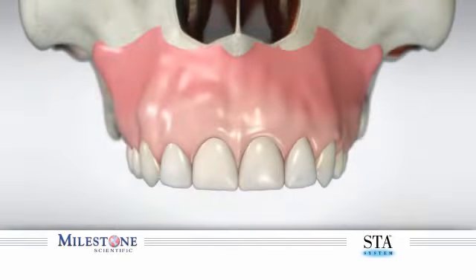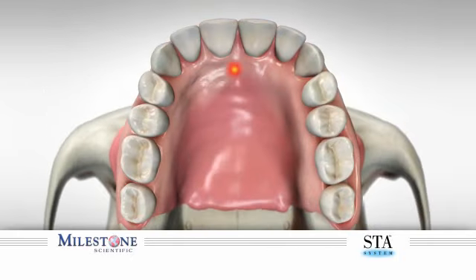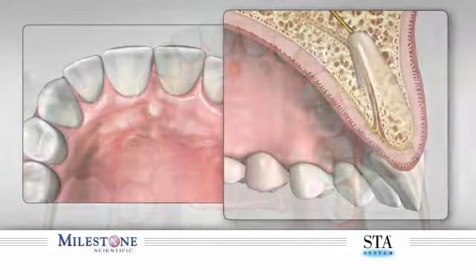Site of injection. This injection is initiated just lateral to the incisive papilla along the incisive groove, while targeting the underlying nasopalatine canal. The objective is to gain entrance into the canal and maintain contact with the inner surface of the bony wall of the incisive canal.